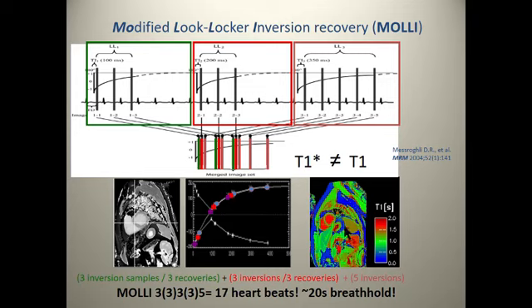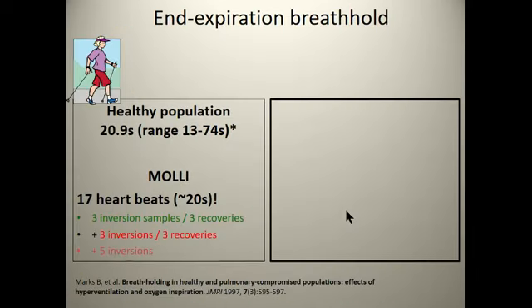So you can see your blood pool here is a T1 of the order of 1600 milliseconds. This is color-coded to the color code we use. So green is used for the healthy myocardium, and you can see all the tissues as well. It works very well. So in Oxford, we were a little bit worried about this.